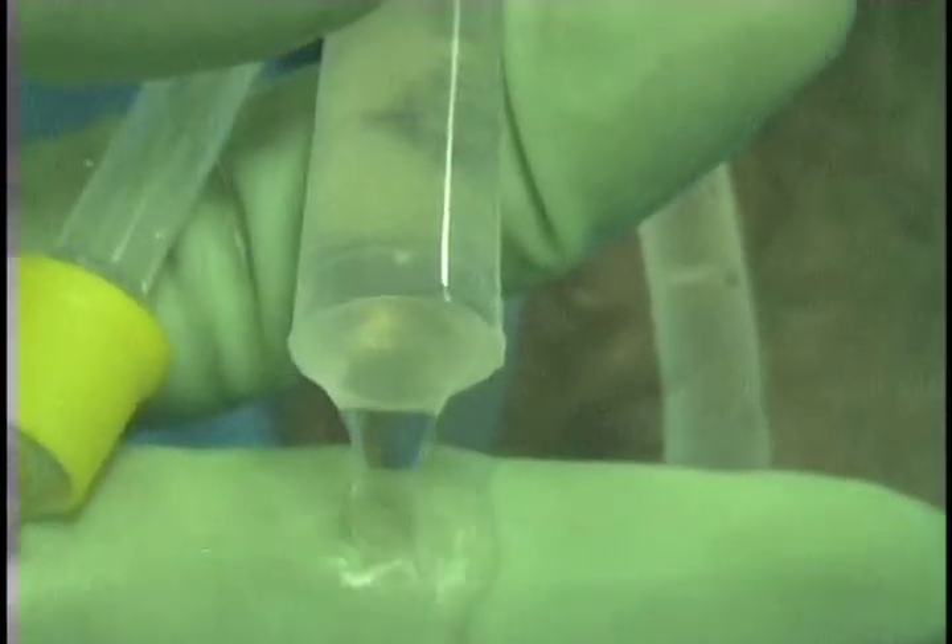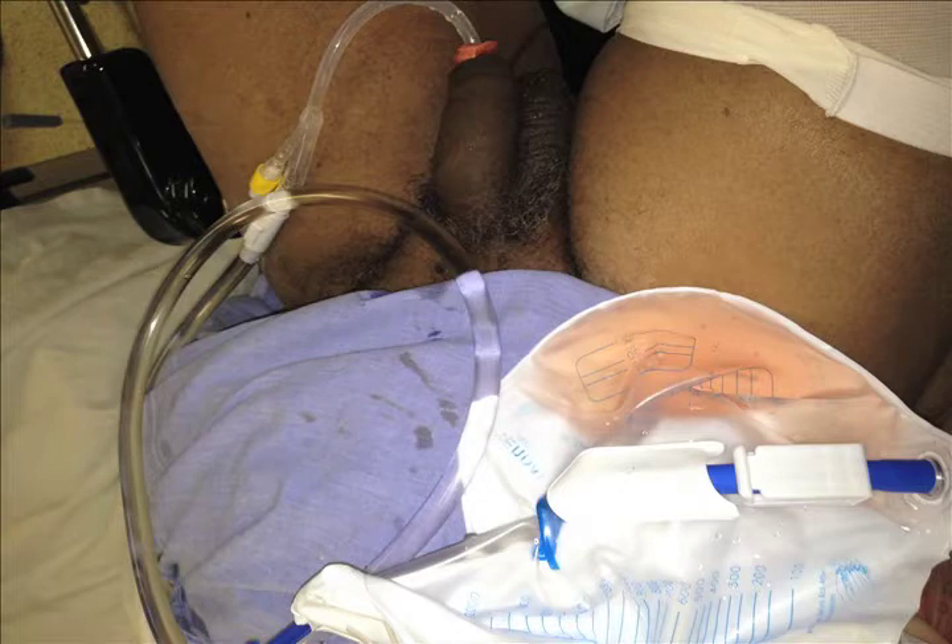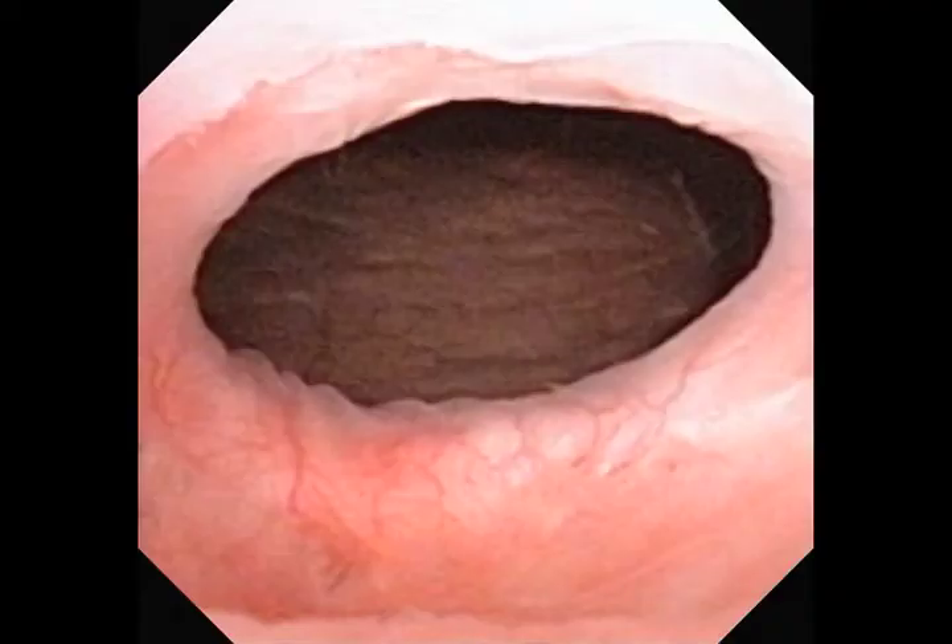We now have a view from the verumontanum near case completion. We stop the water flow, allowing the pressure within the prostate to fully decompress and reveal any areas of bleeding. Those are coagulated, and finally we insert the catheter at the end of the procedure. The outflow is clear — without any irrigation or traction. In the recovery room one hour after the procedure, outflow clarity is demonstrated. The majority of patients are discharged home within 6 hours without a Foley; older patients are kept overnight.